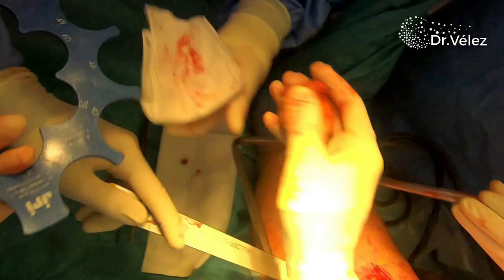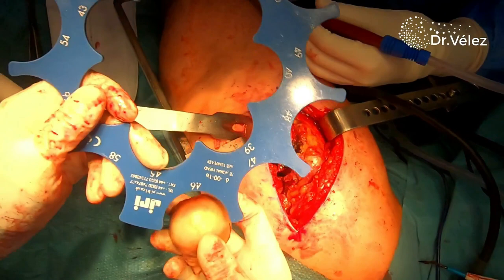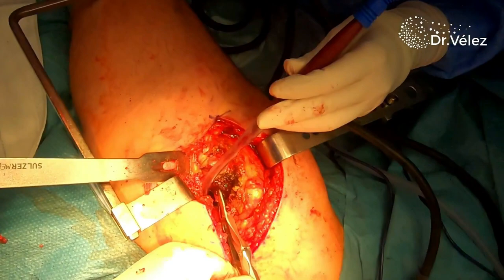Using the standard instruments of the prosthesis that you're using, we measure the femoral head that will be used to select the bipolar component that we're going to implant in the patient. In this case, the femoral head of the patient adjusts perfectly to a 47 millimeter diameter bipolar head.